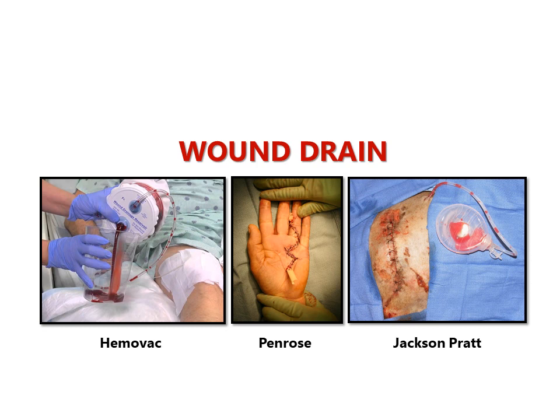First, we have a Hemovac. See, it's a small gadget. It's inserted near the patient's wound, and normally you would expect some wound drainage after several hours from it. And as a nurse, you need to measure how much drainage you have collected in your shift. The second one is called Penrose drain. See, it's like a small film attached to the wound, and you would expect some exudates coming out from the tip of the Penrose.